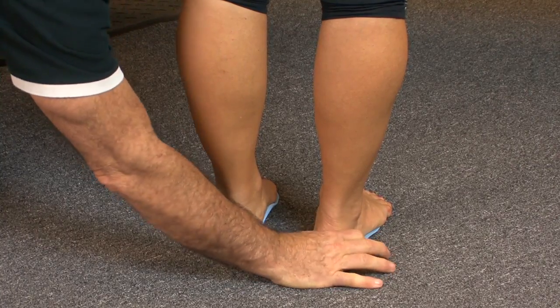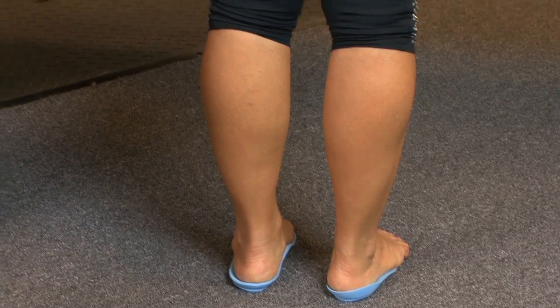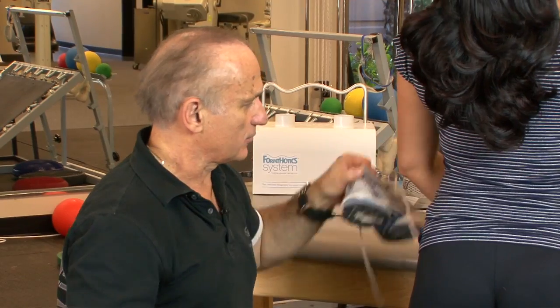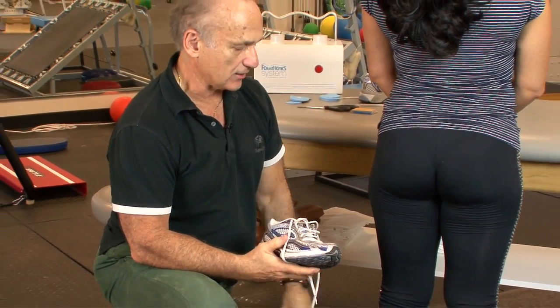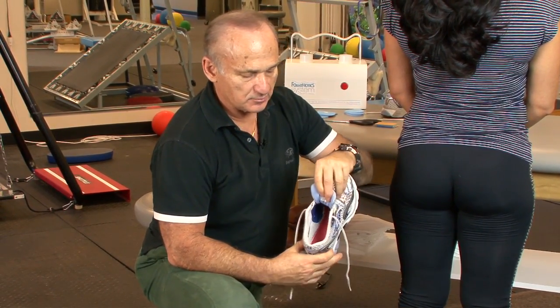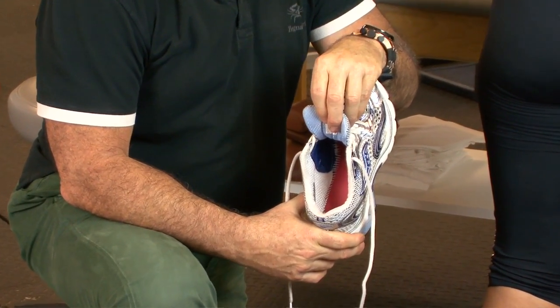There are three parts to an orthotic system. The shoe is very important — you need a deep heel seat in the shoe, a wide toe box to accommodate the orthotic especially if we add a forefoot post, and enough room to fit both the orthotic and the foot at the same time. So the three components are the shoe, the foot, and the orthotic device. You can already see she looks better in these than barefoot.